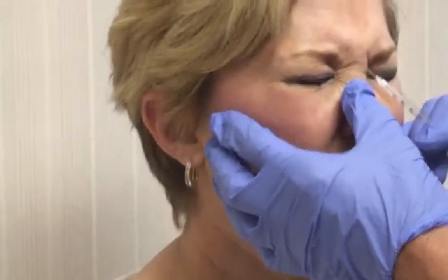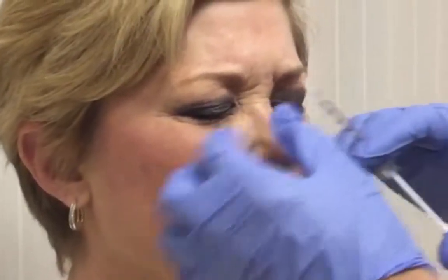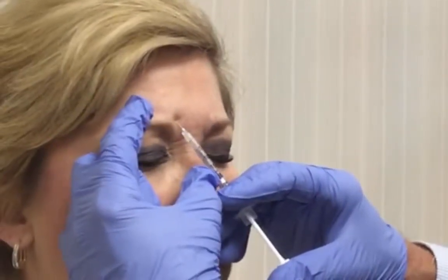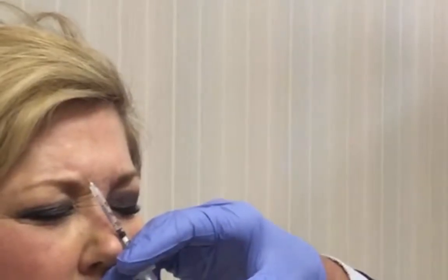Mean face — good. Very good. What I like to do is just lay the needle right on the skin and then ask the patient to give me a mean face. They drive their skin down onto the needle.